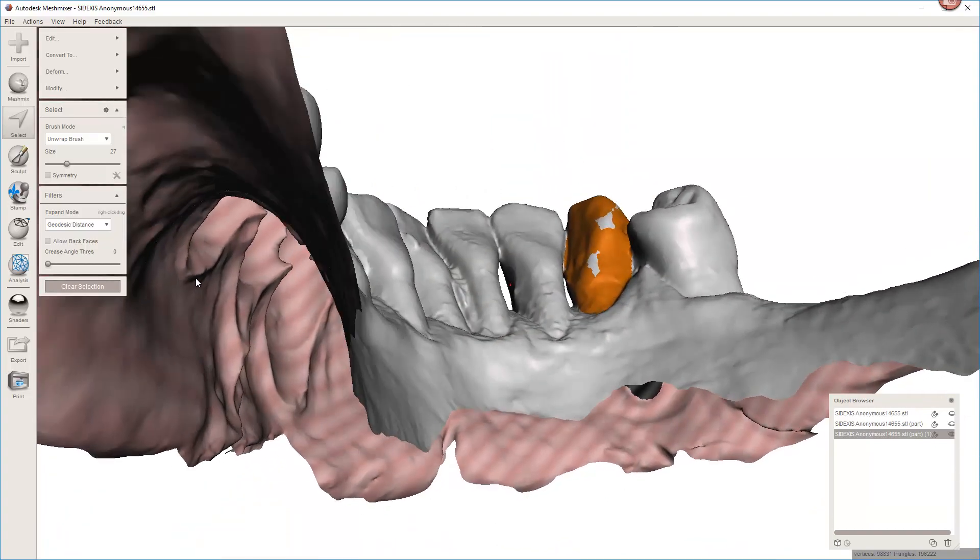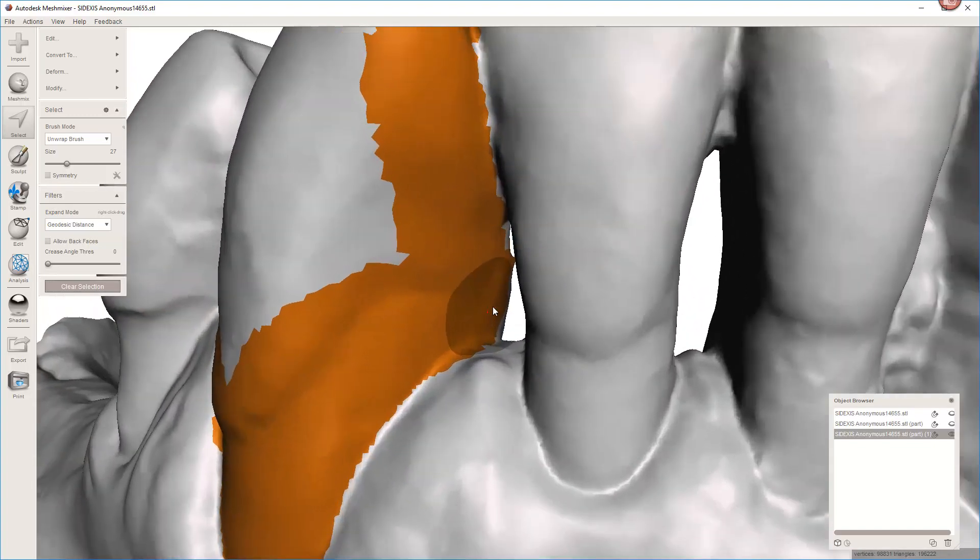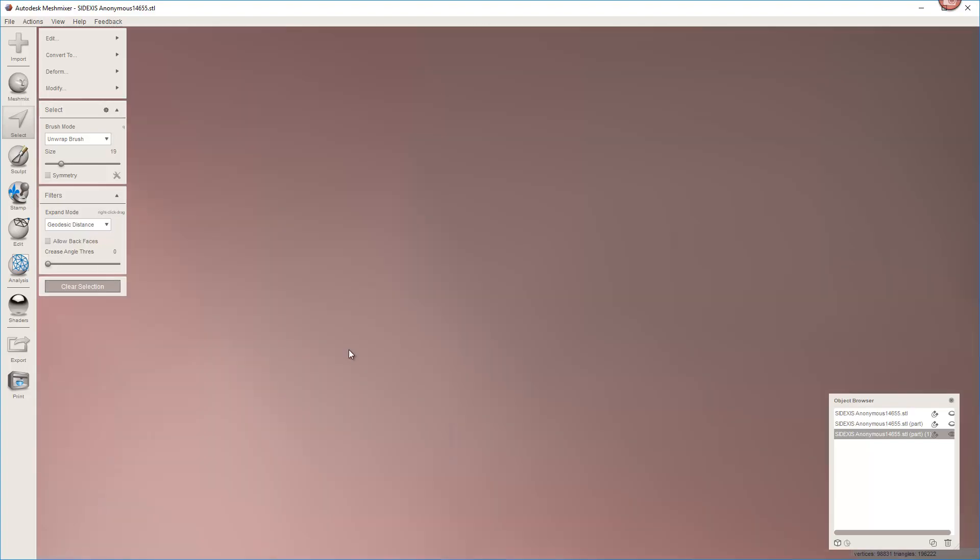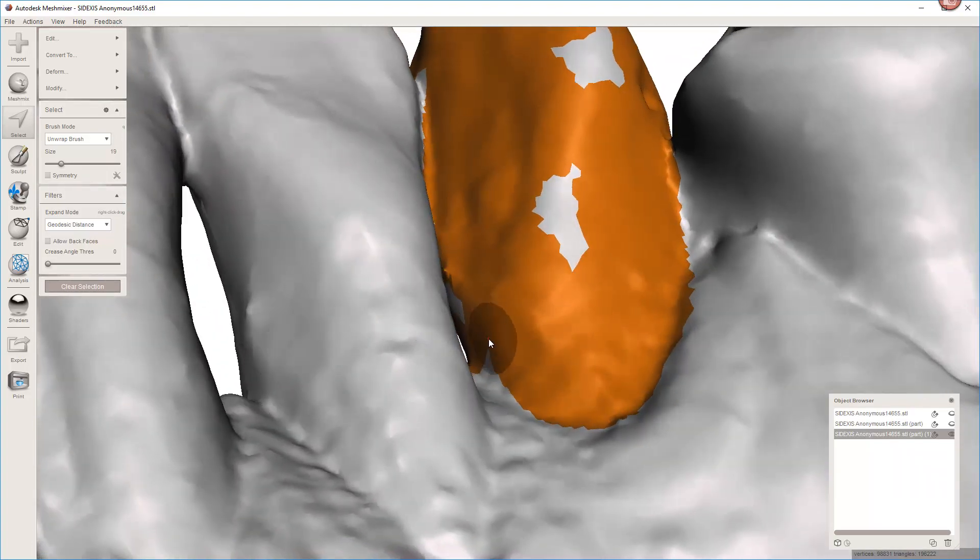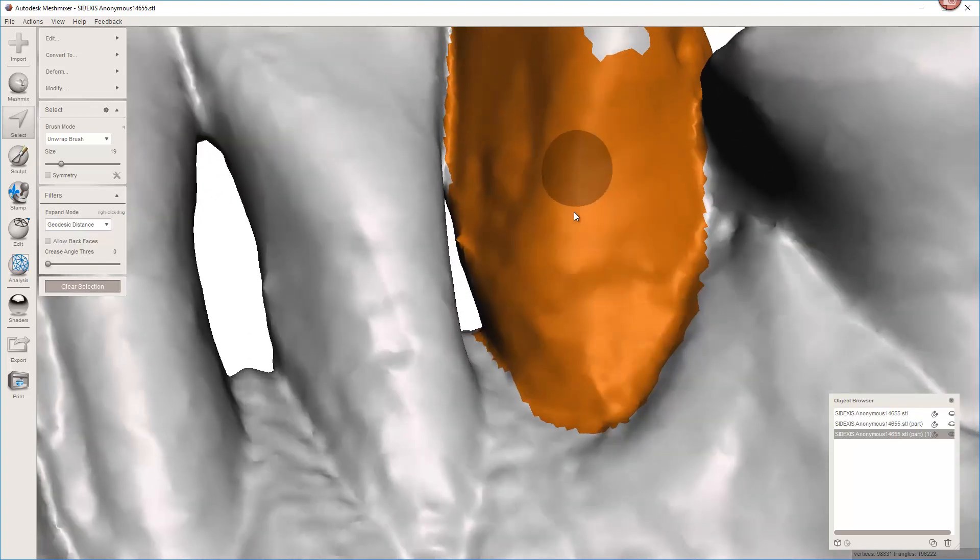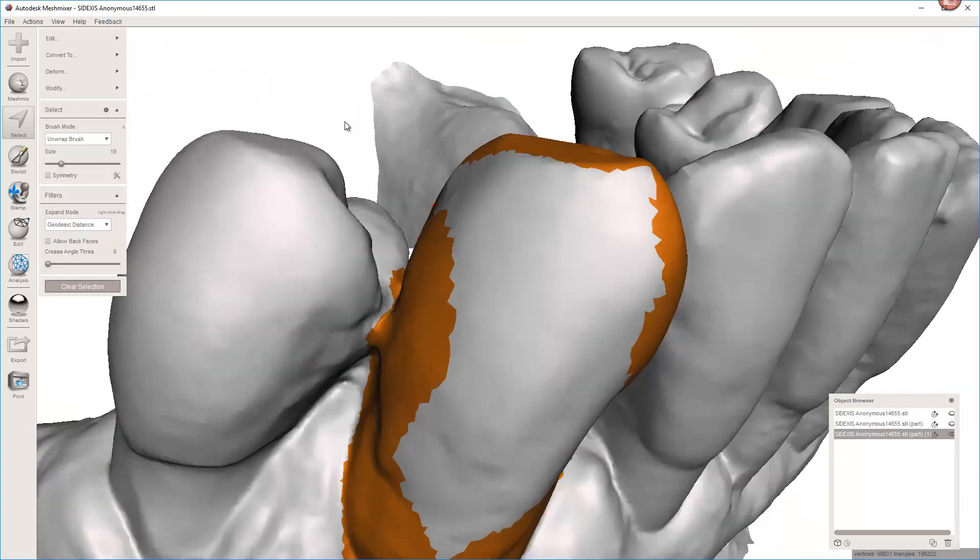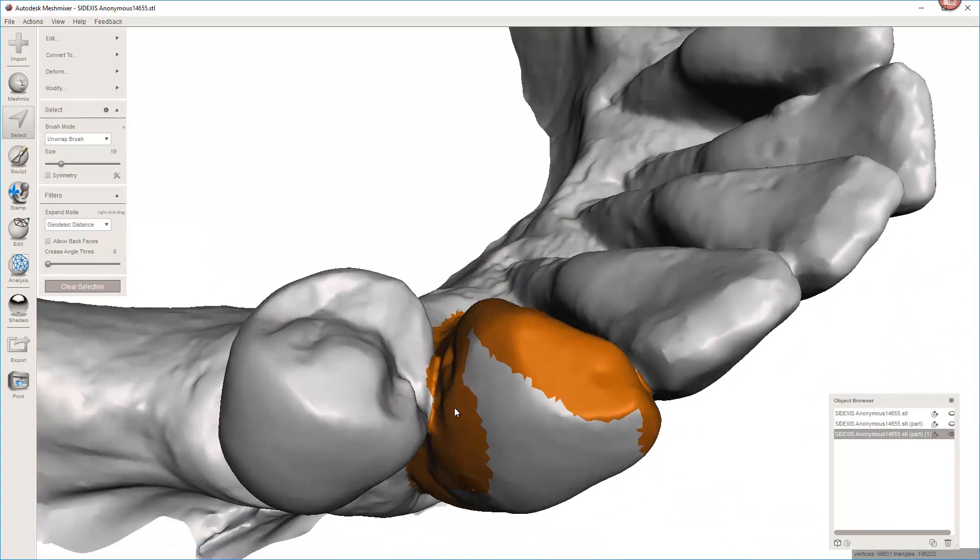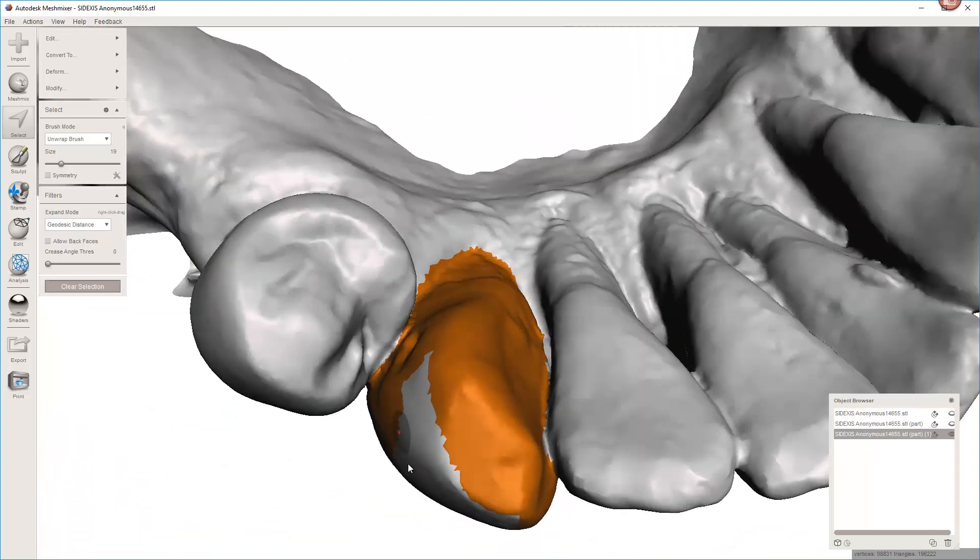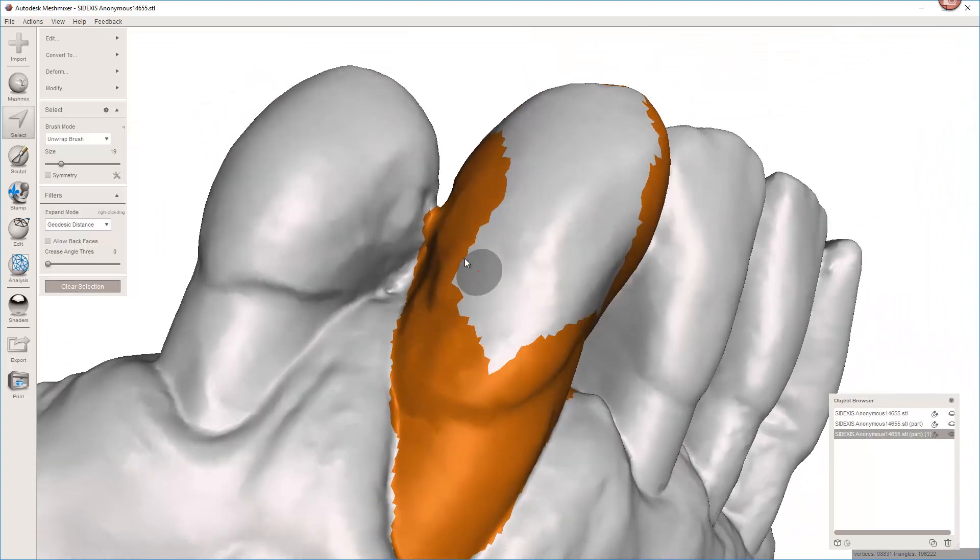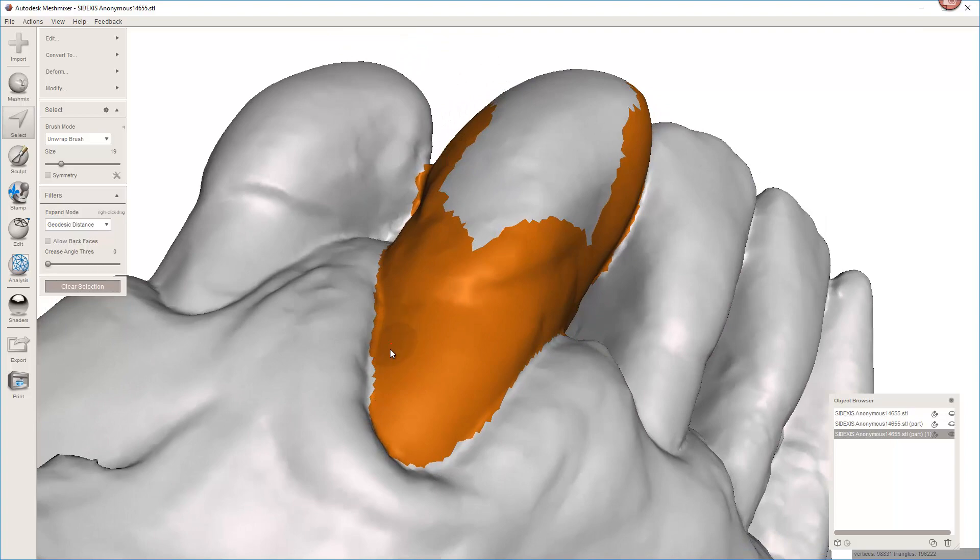So I need to connect these two areas. I'm going to zoom in real far and I'm going to make this selection size even smaller. Let's see if it's connected now. I don't want islands of white. I don't mind if there's a big area, but that's fine. I don't like this. Hold shift. Deselect this surface.